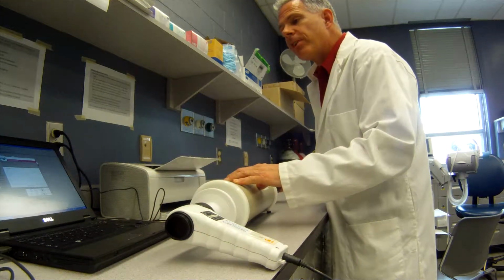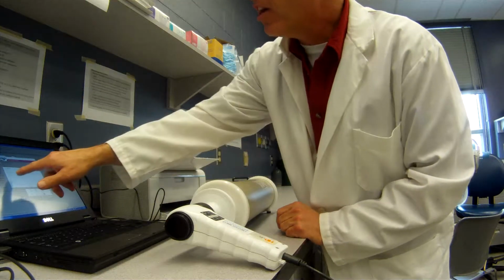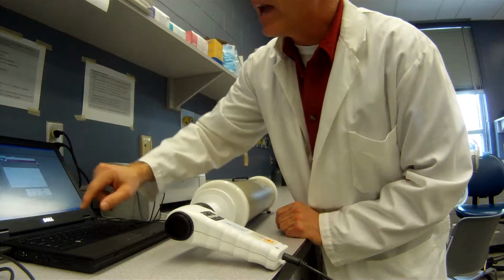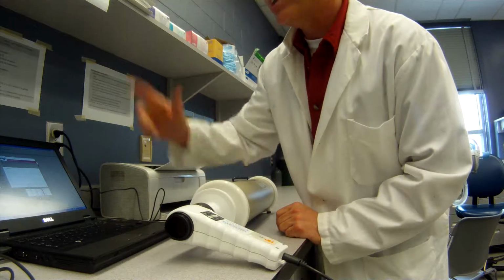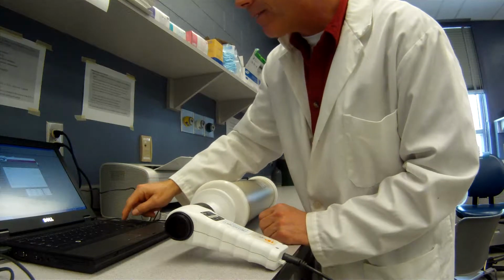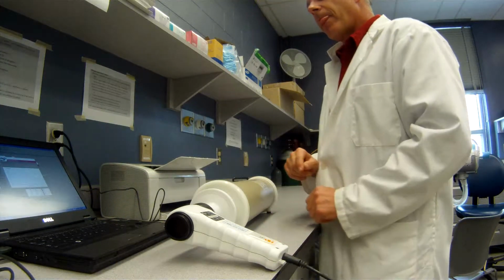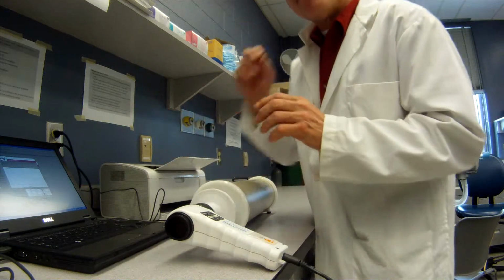This is our calibration procedure. So push it in as fast as you can, or as fast to get the flow rate at about that dotted line. All right, so it's a success. Great, we're calibrated, but we're not quite finished yet. So we hit Continue. All right, now we have to do a verification.